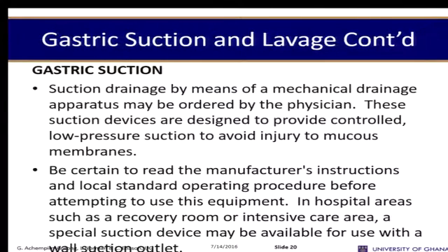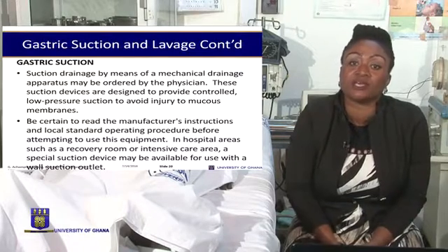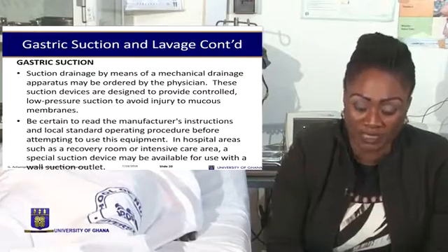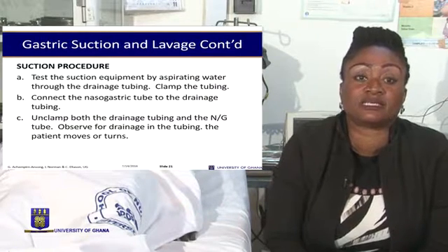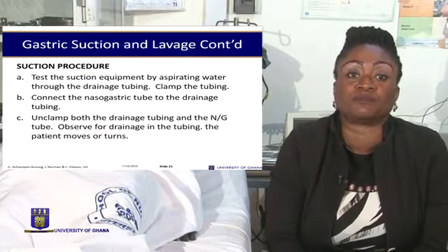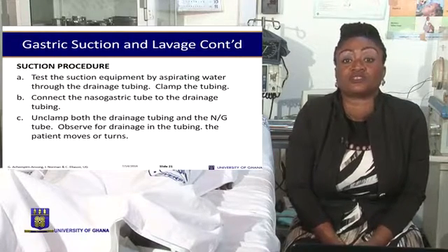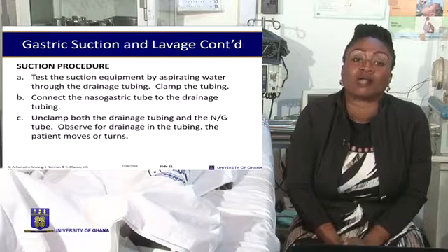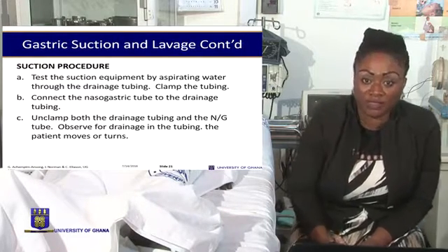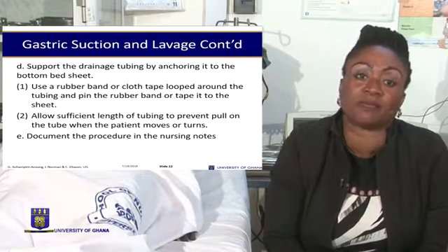Now, the suction is done by means of a mechanical drainage apparatus, which may be ordered by the physician. These devices are designed to provide controlled low-pressure suction to avoid injury to the mucous membrane. It is the responsibility of the nurse to test the suction equipment by aspirating water through the drainage tubing, and then it is clamped. Then the nasogastric tube is connected to the drainage tubing, and both the drainage tube and the nasogastric tube are unclamped and observed for drainage in the tubing. The patient moves or turns. The procedure must be explained to the patient.